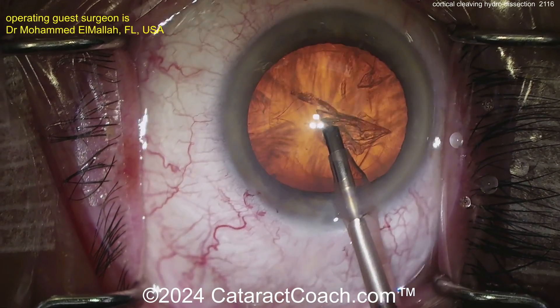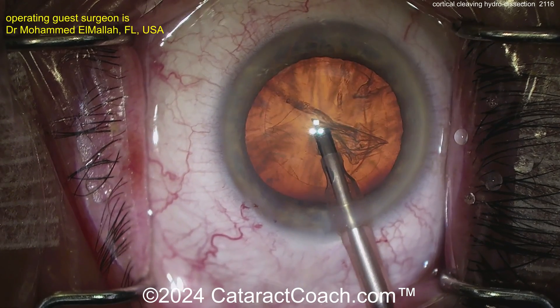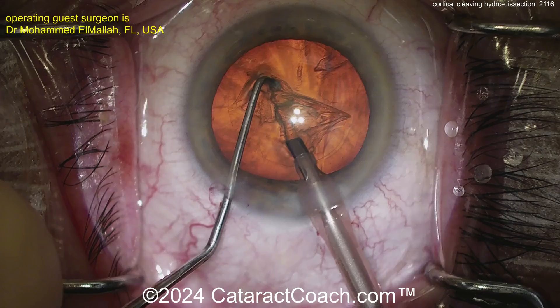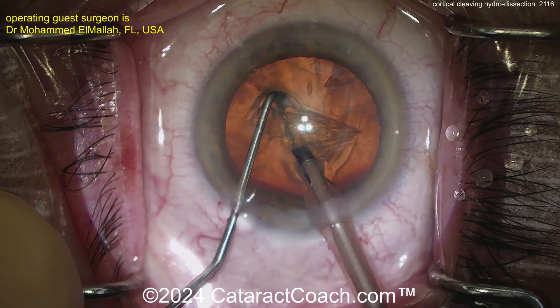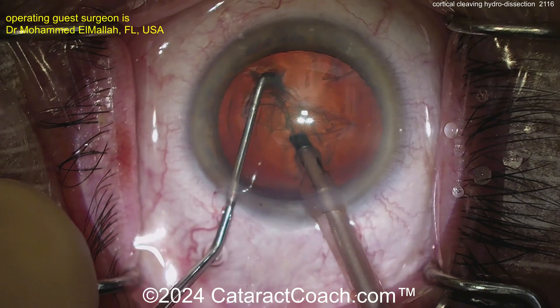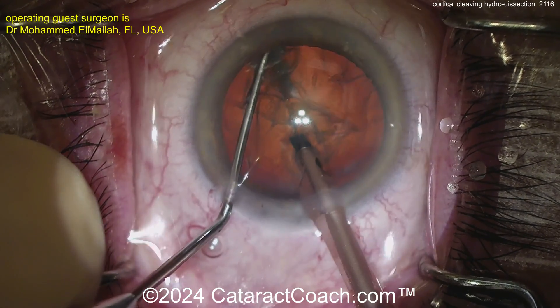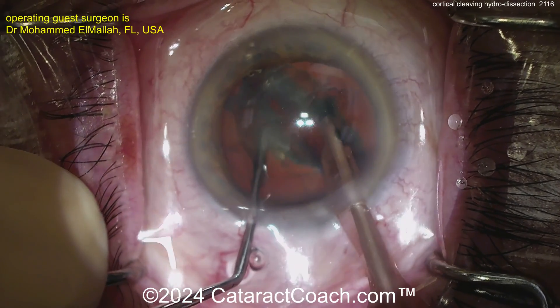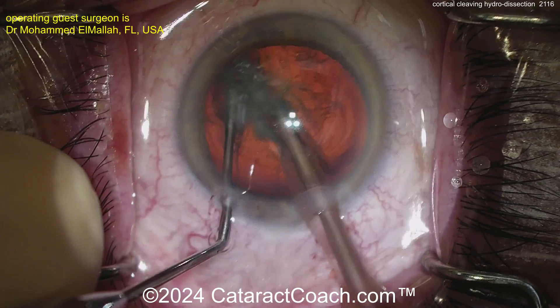At the end of phaco, there should be very little lens cortex remaining. Going in with the phaco probe using a chop technique — looks like a horizontal chop, maybe a combo chop. Go around the lens equator and separate — there are the two halves. Beautifully done.